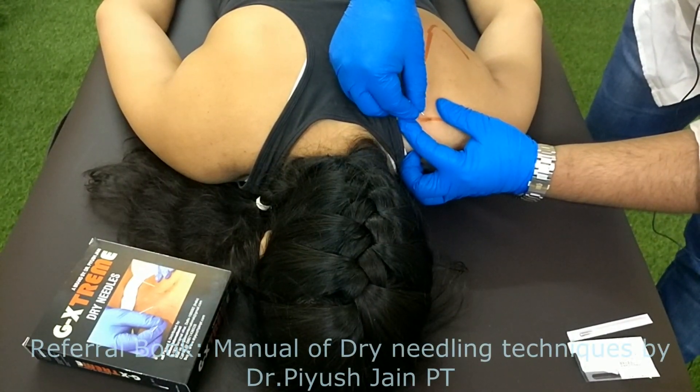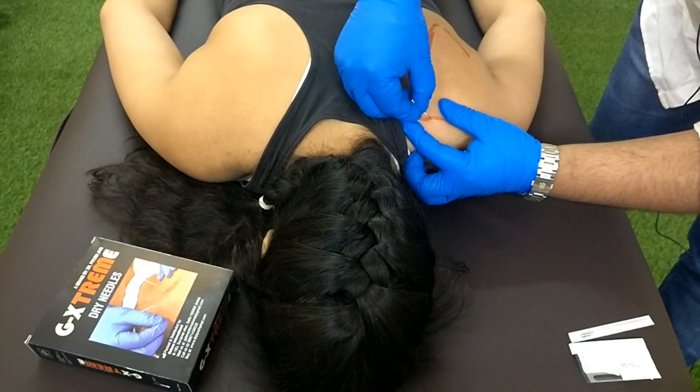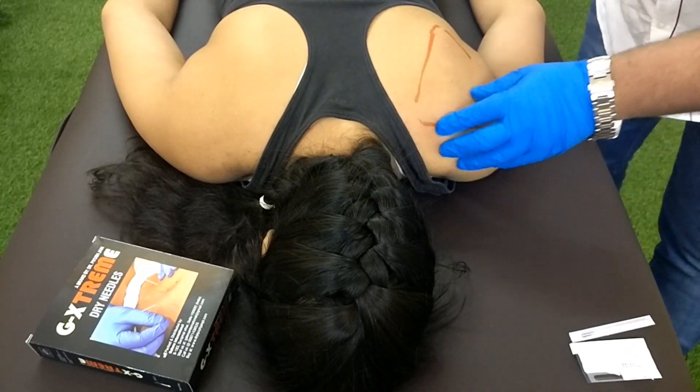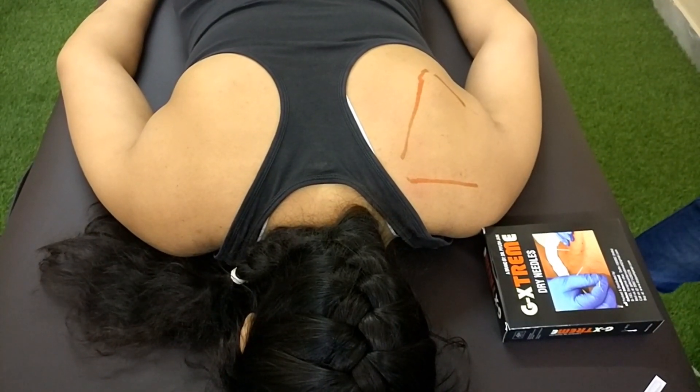Try to stay on the muscle at all times. Once you are done with 30 to 40 pokes, take the needle out. We will then advise the patient on post-treatment care.